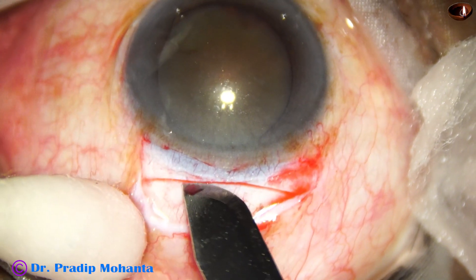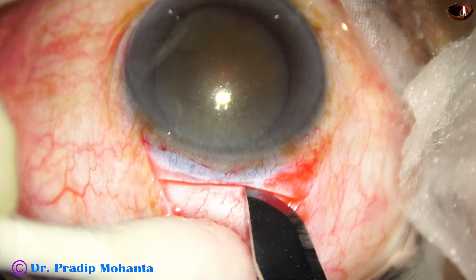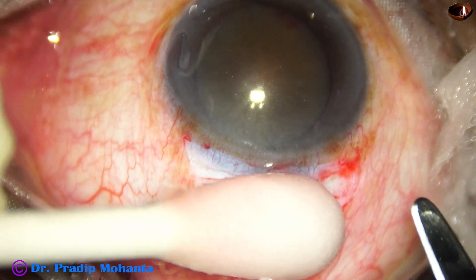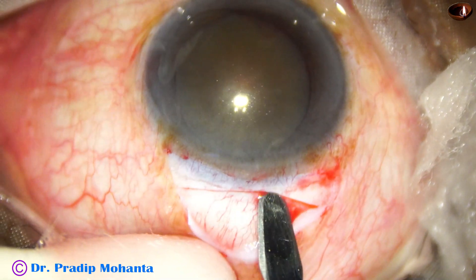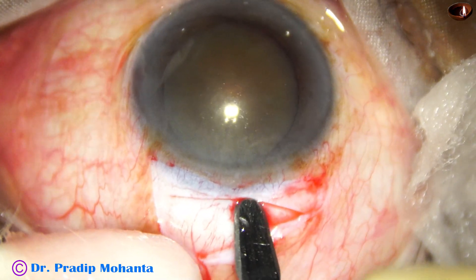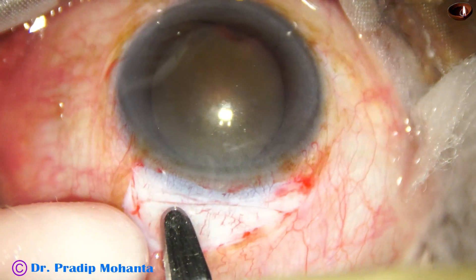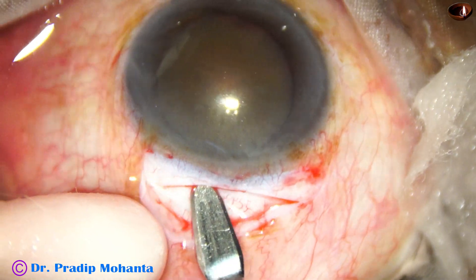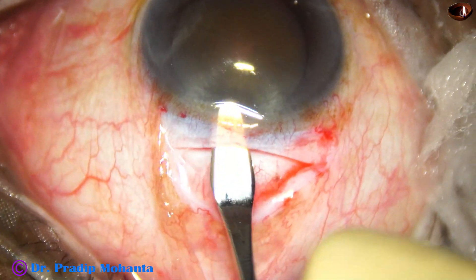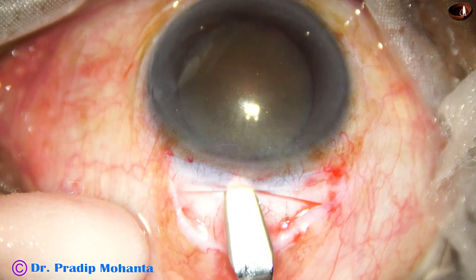This is the incision on the sclera. This should be about 300 to 350 microns in thickness. There are guarded knives available with Appasamy Associates you can use. Otherwise, there is no other way to show exactly how deep to go — you have to teach yourself how much force on the sclera will give an adequate depth for this initial incision.